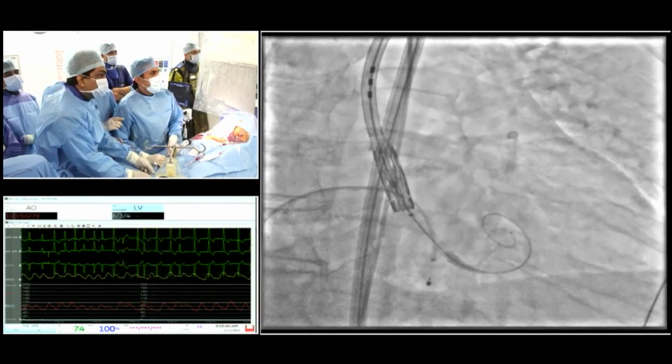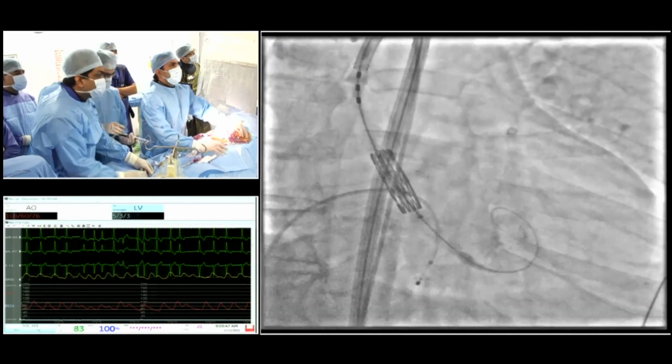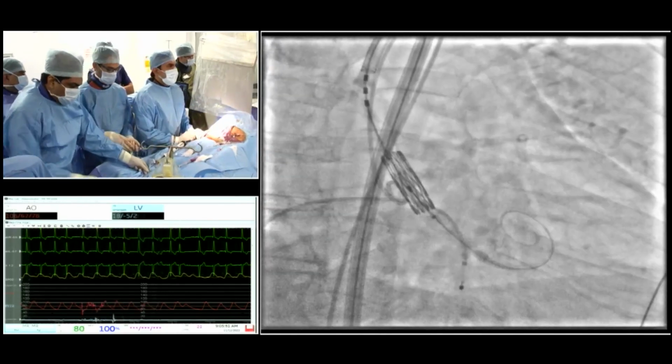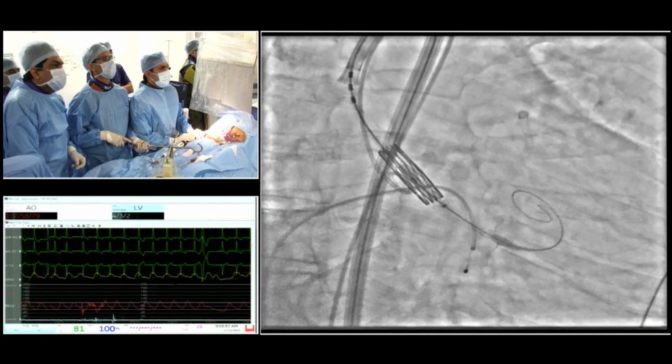You need a lot of radial strength. Evolut or a MyVal or Sapien 3 will be the choice. Bicuspid. Yeah, so you saw how it crossed. And the other thing which you have to also assess: are you on the outer side of the curve or not?